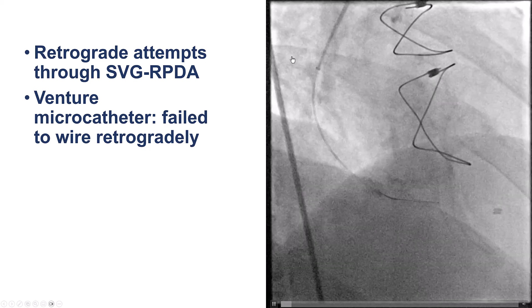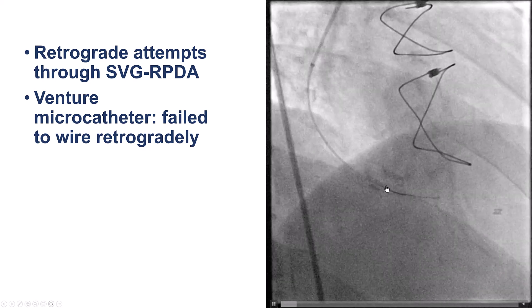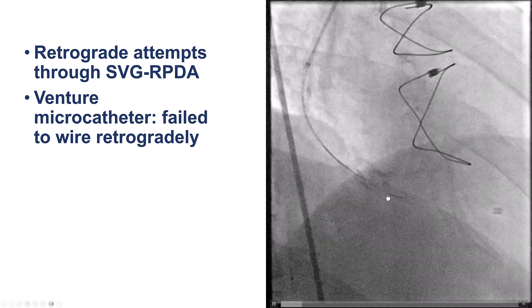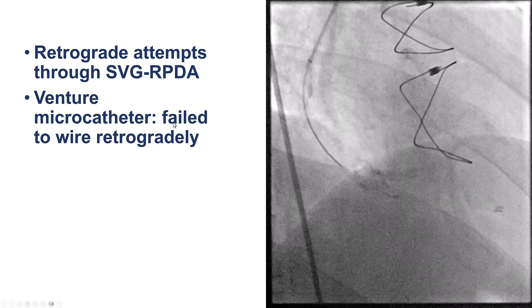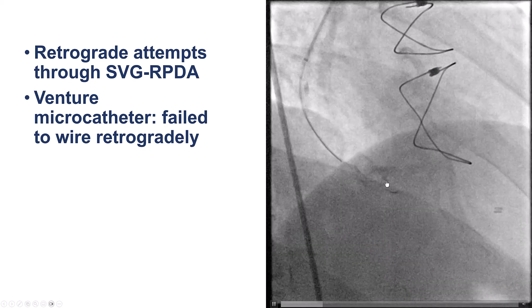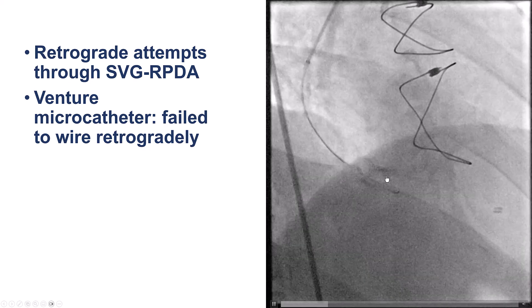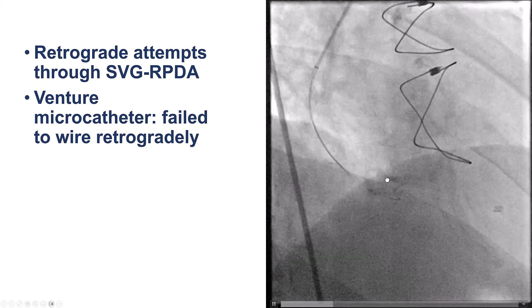We first went down the saphenous vein graft, but despite using an angulated Venture microcatheter, we were unable to wire retrogradely.